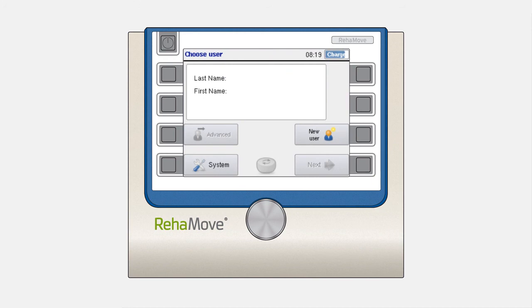When the device starts for the first time, you have the option to create a new user or to check the system via the system button.